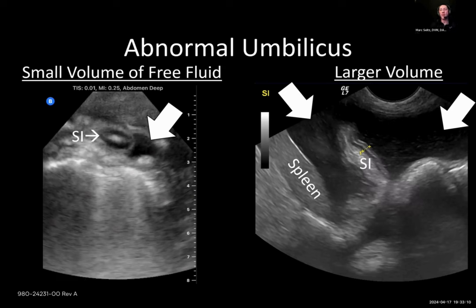Now, again, not going to talk about it today, but this location, the umbilicus, is the number one location for sampling fluid. With an ultrasound, you technically can guide your needle into anywhere the pocket is contacting the near field. You never want to poke through other organs, but this location you can see would be a great place to stick a needle and sample it. This would be just like sampling a urinary bladder. Very easy to hit this large pocket. This, much harder. You want to practice before you start going after these, but over here, absolutely get some of that fluid.